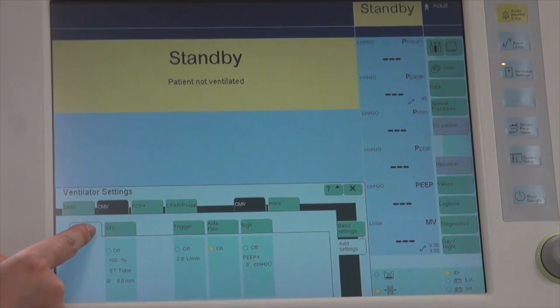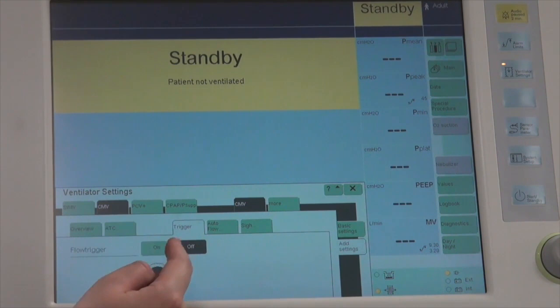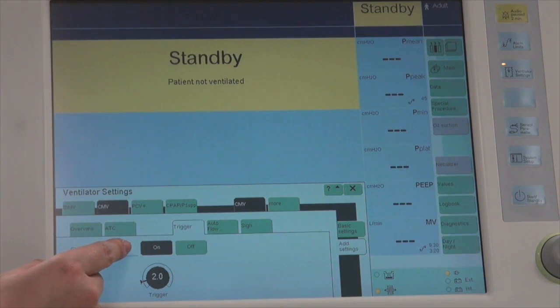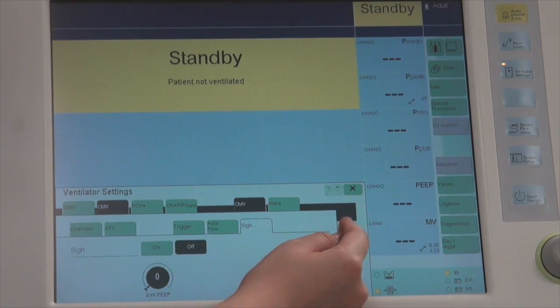Under additional settings: ATC stands for Automatic Tube Compensation. If turned on, you need to set the tube type — endotracheal or tracheostomy — and the tube diameter. However, we don't often use ATC as it may provide too much support and we would be unaware of total system pressure. Next is the Trigger, which is how the ventilator senses that a patient wants to take a breath — this must be turned on. When selecting any setting, it turns yellow and must be confirmed with the rotary knob; after confirmation it turns a darker shade of green. Additional options include Auto Flow (on or off) and Sigh Breaths.